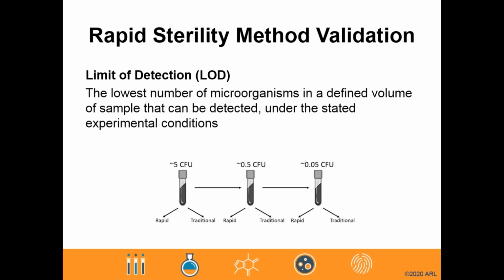The limit of detection, or the LOD, is defined as the lowest number of microorganisms which can be detected under the stated experimental conditions. To determine the LOD, suitable diluent solutions are inoculated with a serial dilution range of each challenge microorganism from the panel previously defined.